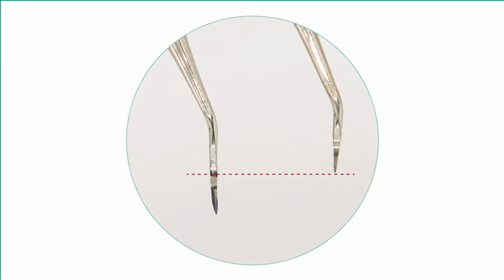But you can begin to assess what errors you may have made when getting the results, such as the instrument on the right. Can you figure out what may have happened when this instrument was sharpened? More than likely, the stone was turned inward while approaching the tip, and it also looks like someone sharpened the tip end. The tip end on sickle scalers should never be sharpened. The result? A shortened instrument, leaving it impossible to completely reach the interproximal, potentially missing calculus.